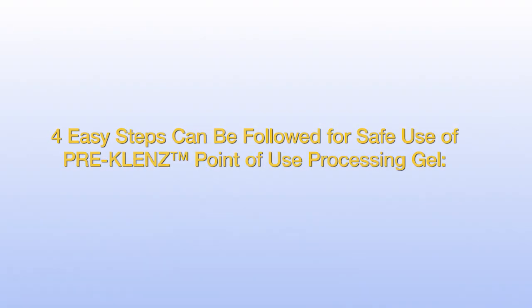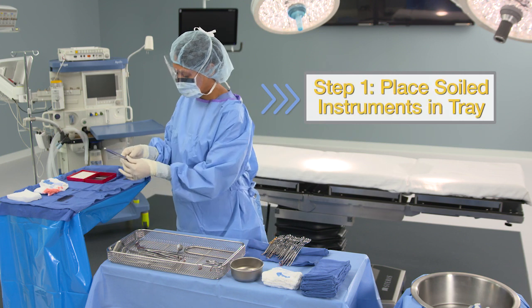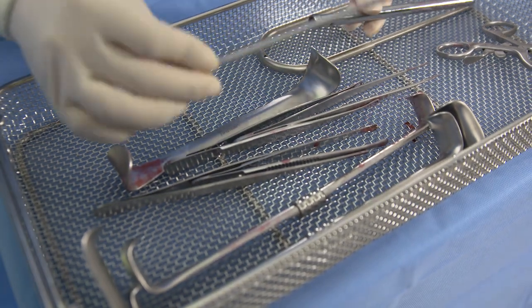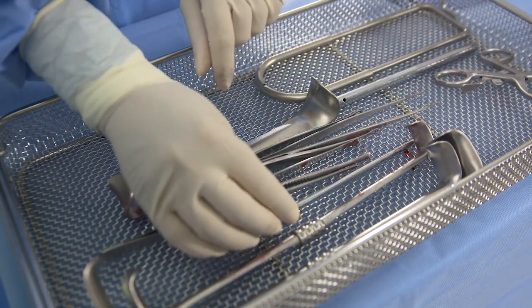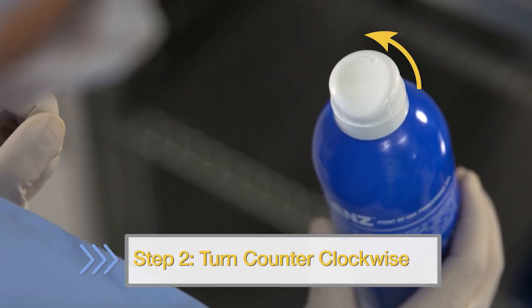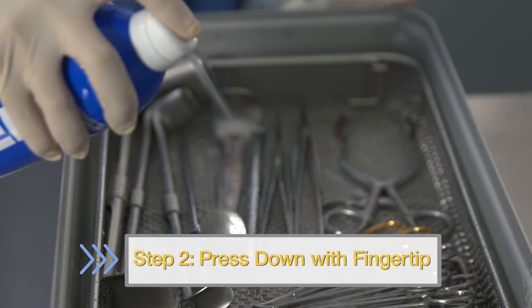Four easy steps can be followed for safe use of Pre-Cleanse point-of-use processing gel. Step 1: Place soiled instruments in tray. Step 2: Turn the cap counterclockwise to the unlocked position. Press down on the cap with your fingertip to begin dispensing.